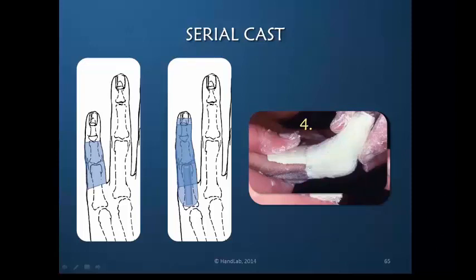The great advantage of this technique is that I can hold this firmly because the plaster of Paris underneath is hardened, and I can precisely position the PIP joint without putting pressure over the dorsum of the PIP joint. In our new system we have two much longer lever arms that give us more control over precise positioning of PIP joint extension — simply using mechanics in a very smart way to get better purchase.